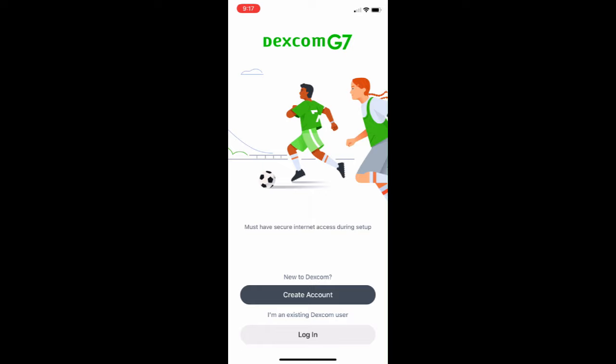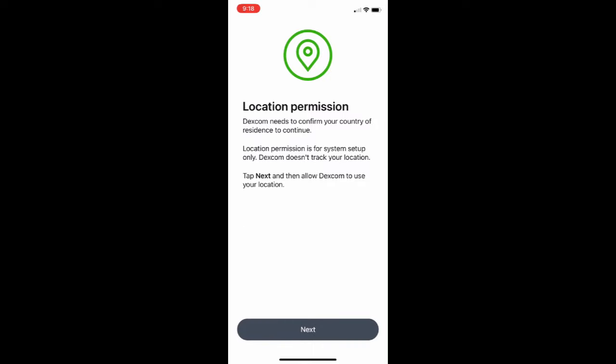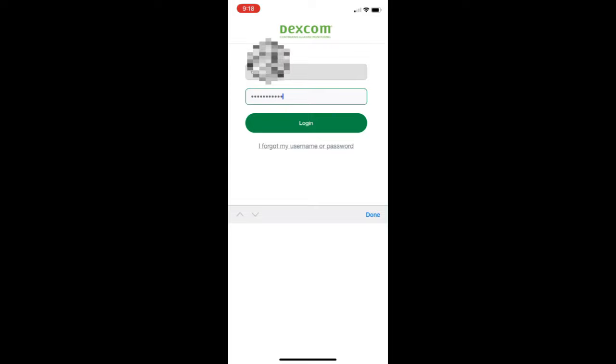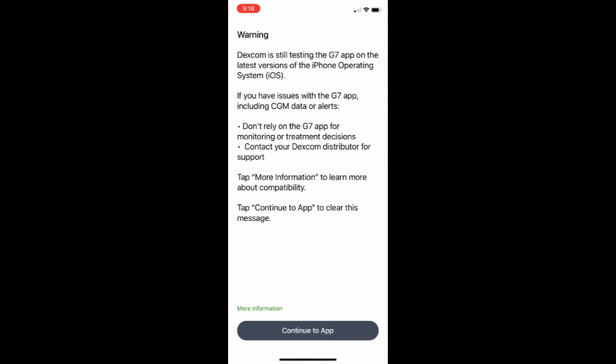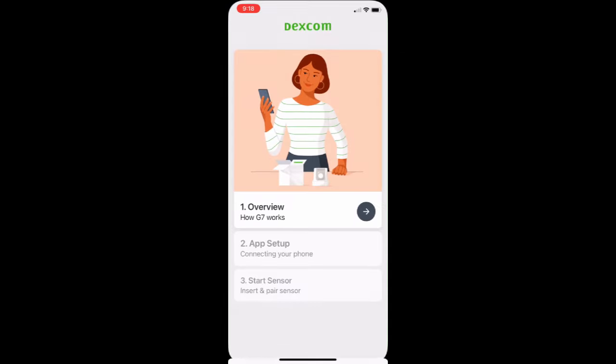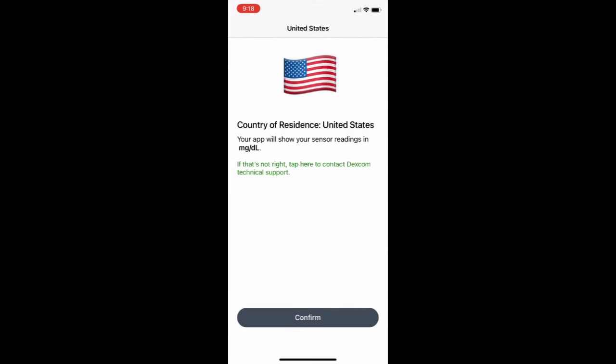First it's going to come up with a notification asking where you're located — it needs to know if you're in the US or another country. Just click Next, then log in with your credentials — your username and your password. It's going to come up with a warning, the same warning they had for G6. You have to agree to their legal policy; if not, you can't use the product. Then confirm that you're in the US by clicking the confirm button.